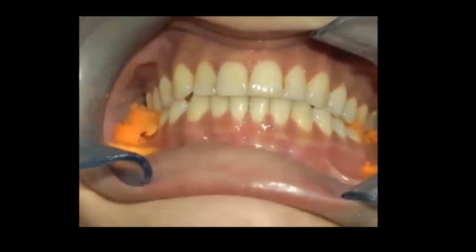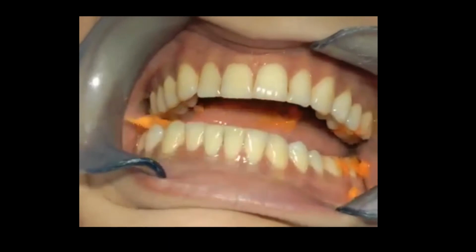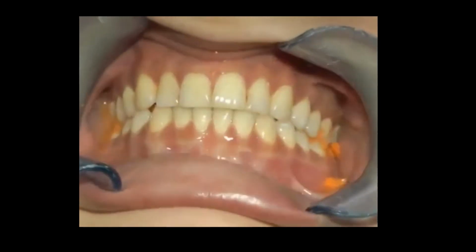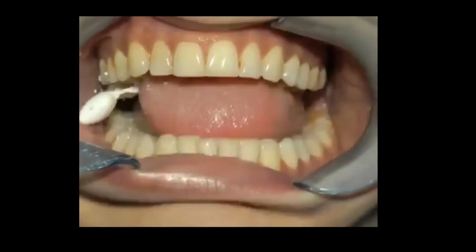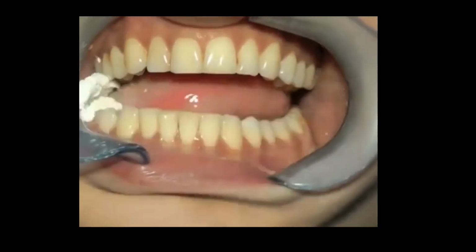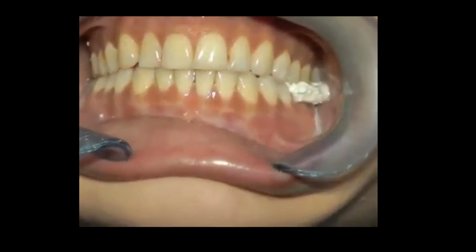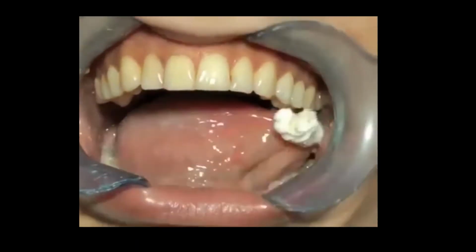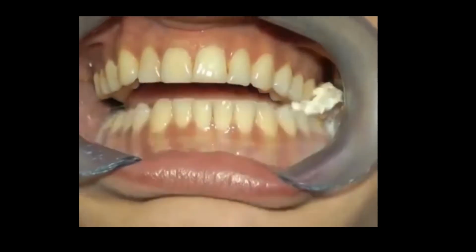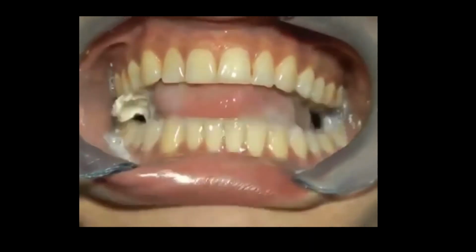So you can actually even see the teeth, look at it coming in at an angle, right? So the mouth is programmed so that the teeth come in at a certain degree. They come together and touch. So this is a mortar and pestle system. The teeth are there to crush the food and mince the food, and it works within a chew cycle shaped like a teardrop. You can actually see the patient touch together, touch and slide and open. So there's that degree of freedom in there.